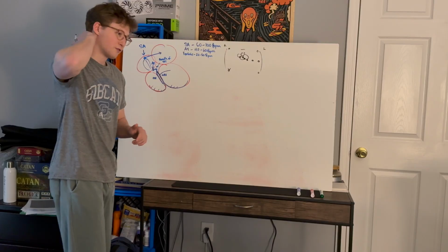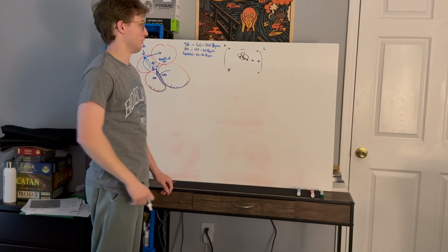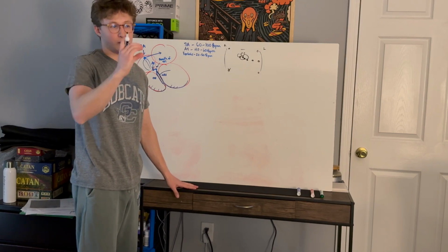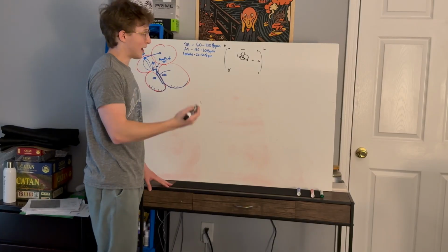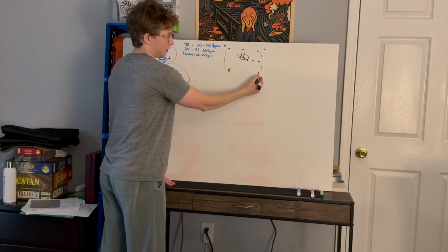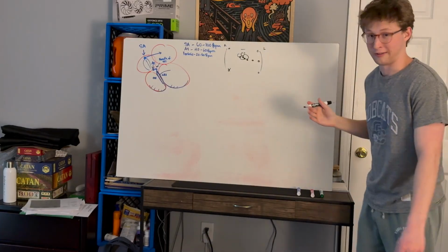So for most floors, unless you're in the ICU and they specifically have a 12-lead ECG ordered, you're usually just going to have on the monitor the one that they will keep on, which is lead 2. Why is that? Lead 2 takes this electrode, the left leg, and sets it to positive.